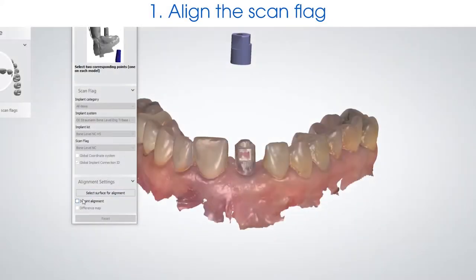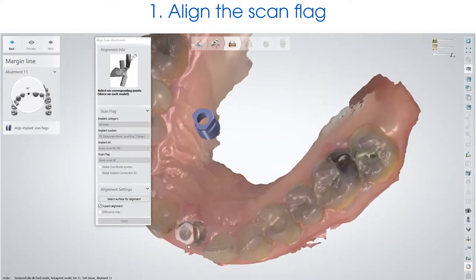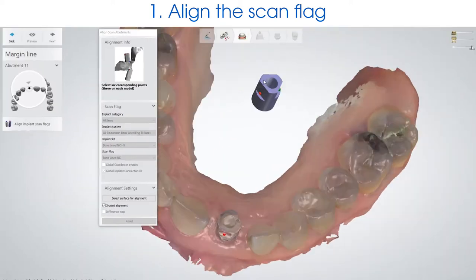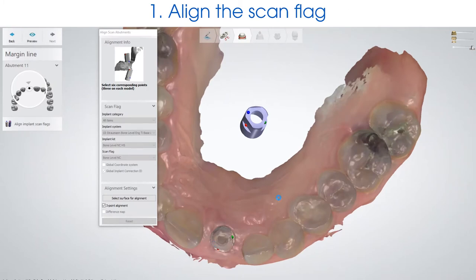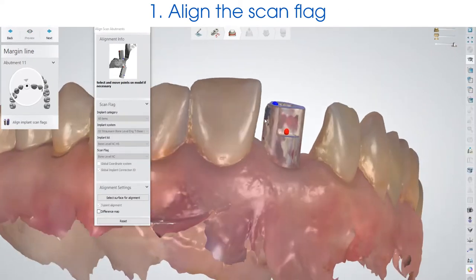The first step is to align your scan flag. Use the three-point alignment — this will give you more surface area to align to and give you a better overall mesh. This is an important step; if your scan flag is not aligned properly, you will have an inaccurate design. This is the look you're looking for: a mesh appearance.